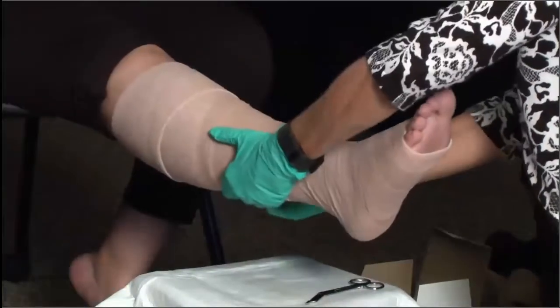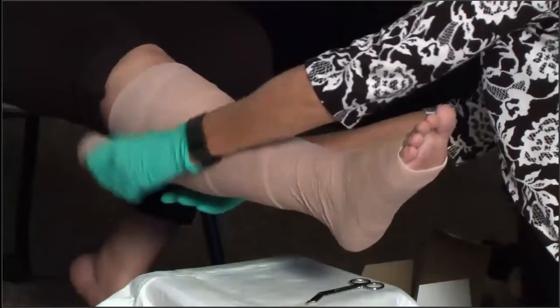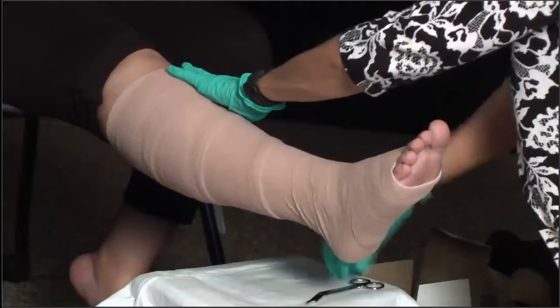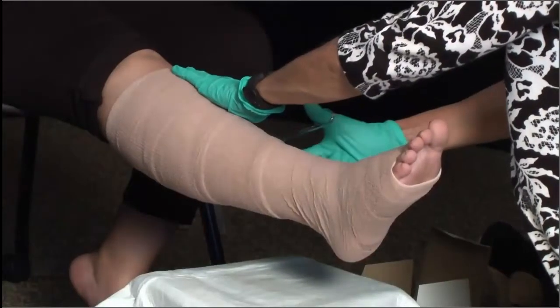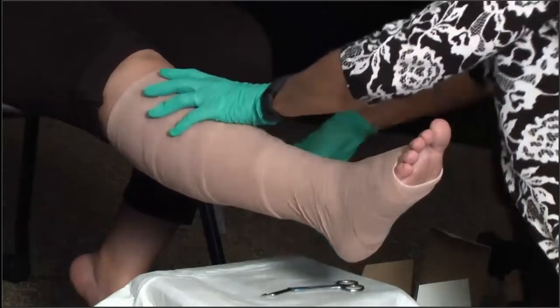Again, this wrap will continue all the way up with a 50% spiral overlap. That should be it — we will cut off the excess and secure that with a piece of tape.